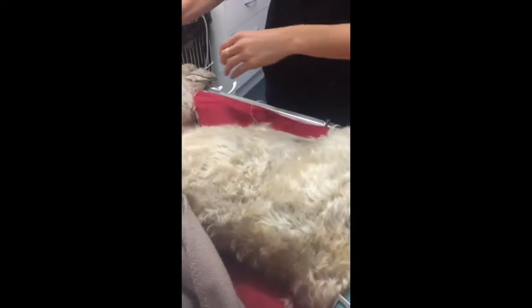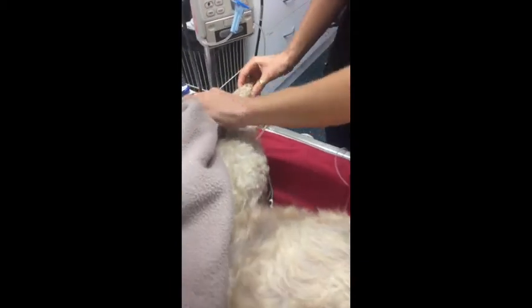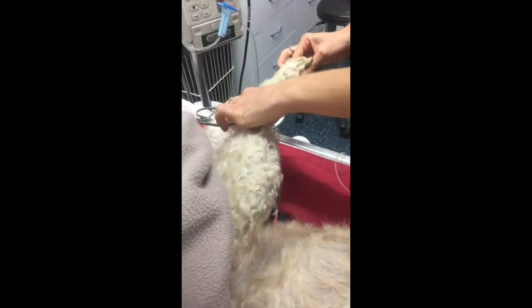The animal is then checked for the presence of a withdrawal reflex. This is a spinal reflex, which is in reaction to what the body believes to be a threatening stimulus, basically. So by pulling firmly and pressing tightly between the animal's toes, a reflex retraction of the leg will occur if the anaesthesia is probably too light.